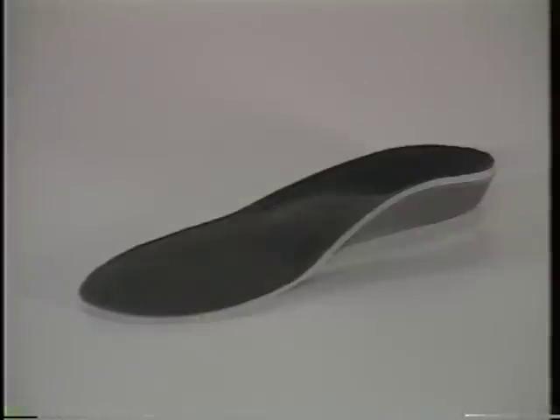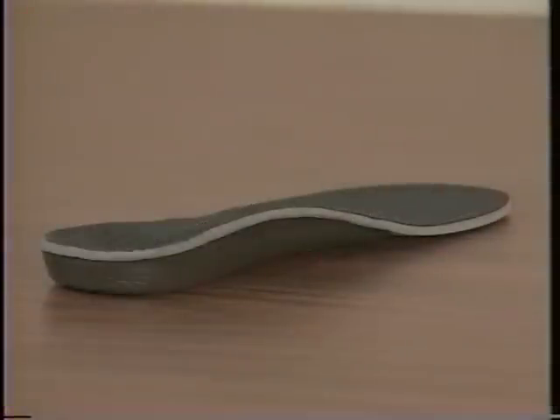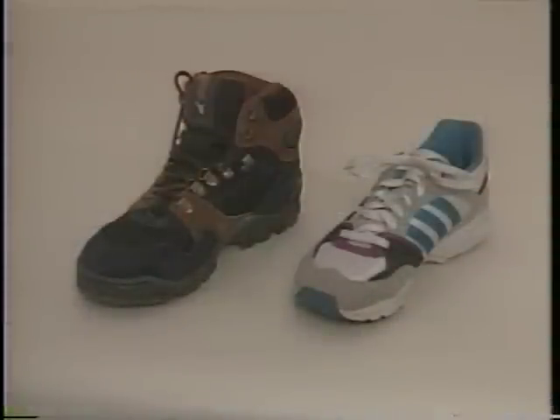The Sport BioThotic is a semi-rigid orthotic similar to the ProFunction, but includes a thicker EVA cover for additional cushioning. It is recommended for shoes with removable inserts or shoes with extra room.